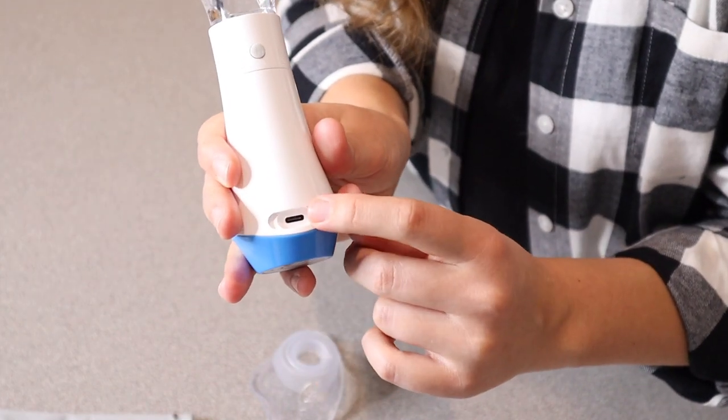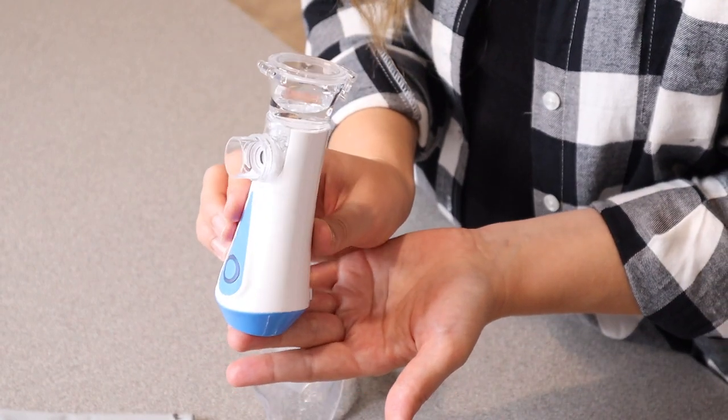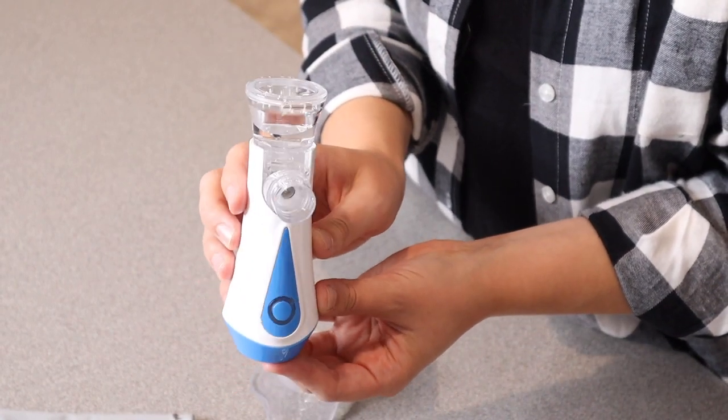The little charge port is right here in the back behind this little waterproof piece. Overall I love how portable this is, and it's going to make it a really reliable accessory for when you need it.